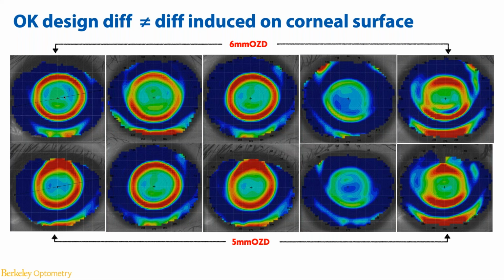And the reason that paracentral steepening is not perfectly round was because she actually wore the lenses to school for the follow-up. And so the fitting of the lens in her waking eye and sitting up position was very, very different than her closed eye condition, hence creating a little bit of a secondary molding in her several hours of waking up wearing the lenses.